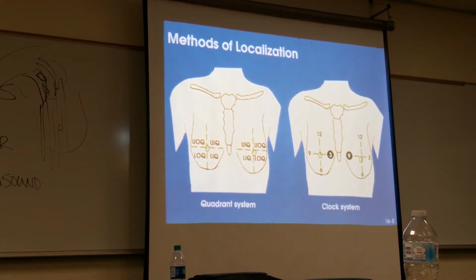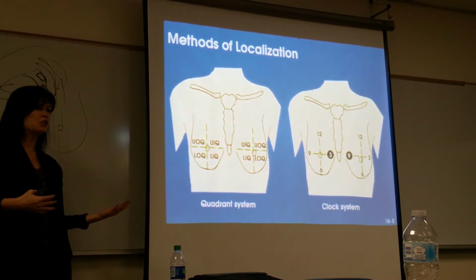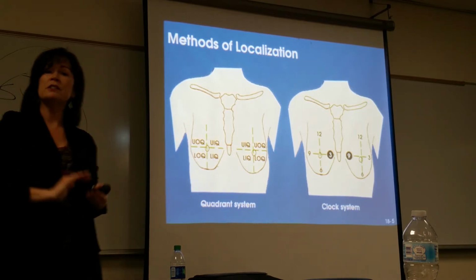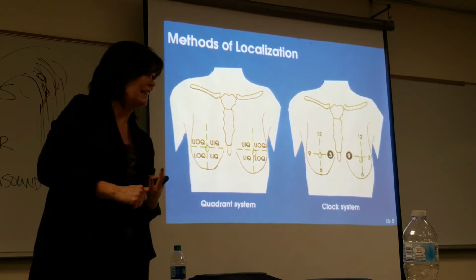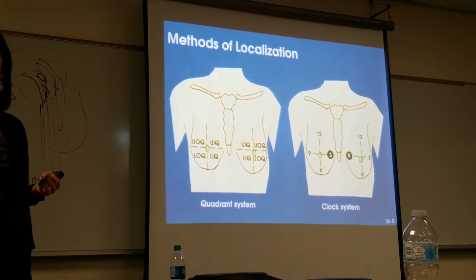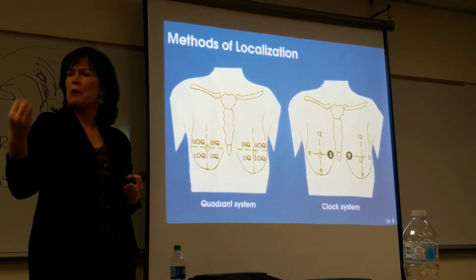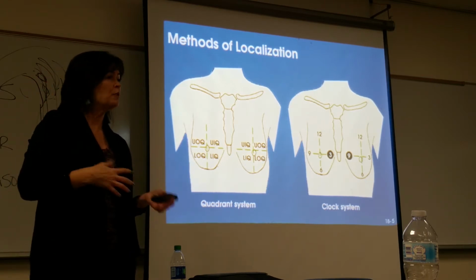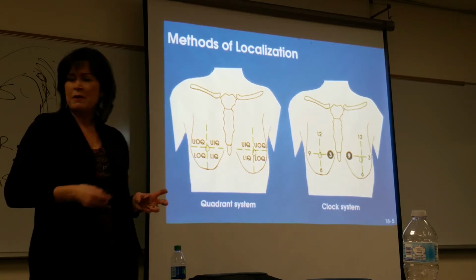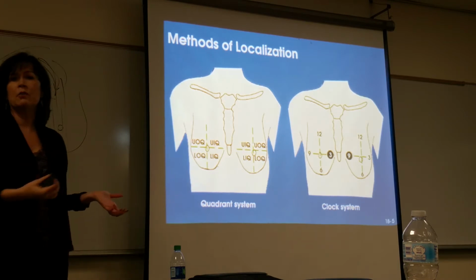When we image breasts, we always, of course, get a patient history. You're going to ask the patient a series of questions, but certainly one of them is, why are you here? Is this just a routine checkup? Did you feel anything? If they have felt something, or when you're looking at the breast tissue, if there's a mole, a scar, anything that might show up on the image, then that needs to be documented. We let the radiologist know, probably written, in what quadrant we found that: upper outer quadrant, lower outer, upper inner, lower inner quadrant.